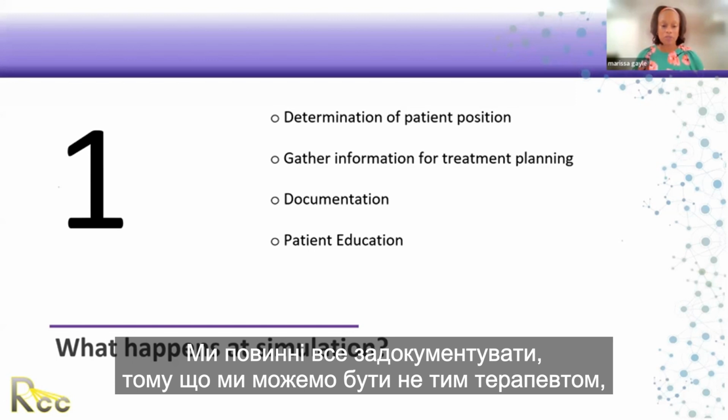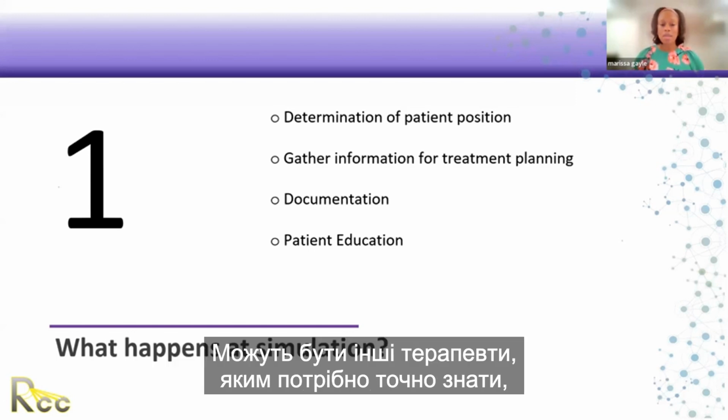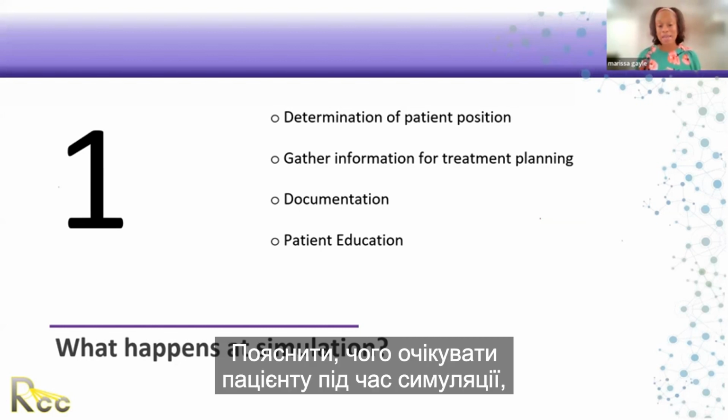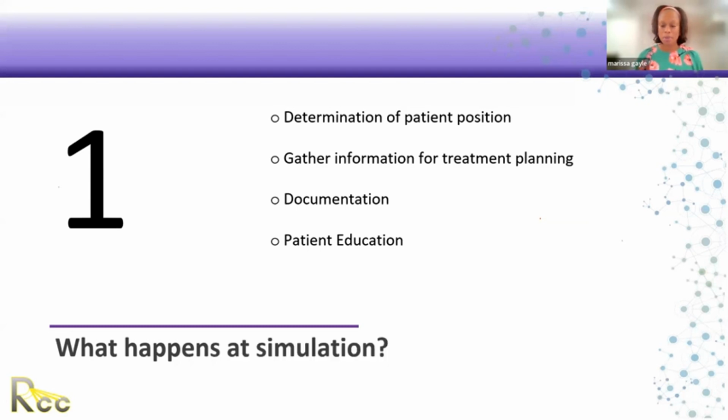We've got to document everything because we may not be the therapists that will be treating. There may be other therapists that need to know exactly what we did in case we're not there. And patient education could be twofold: to explain what the patient is going to expect at the time of the sim, to give them a run-through of what to expect, and also what to expect during treatment.